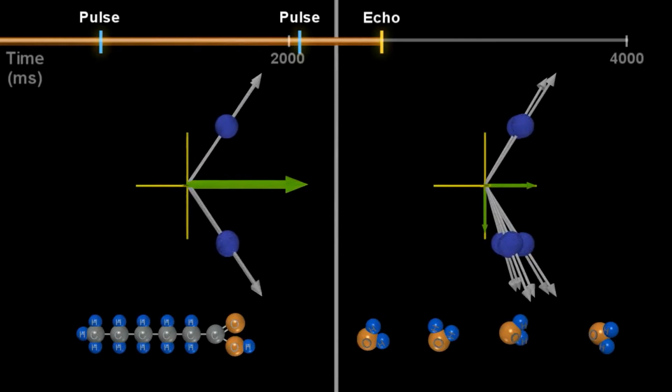Therefore, to accentuate the differences in the T1 relaxations between the protons in fat and water, we want to rapidly put in our resonant radio frequency pulses, or a short repetition time TR, and quickly listen for the return signal or short echo time TE.